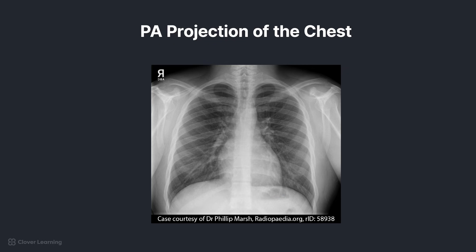Now let's count the ribs to make sure this image has sufficient inspiration. We always count the posterior ribs on the right side because the right hemidiaphragm is higher because of the liver. 1, 2, 3, 4, 5, 6, 7, 8, 9, 10 above the diaphragm, and you can see number 11 just below.